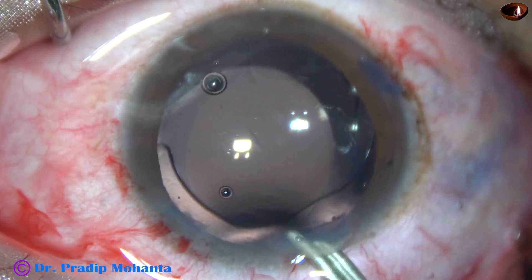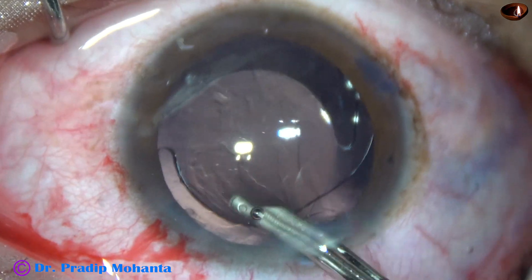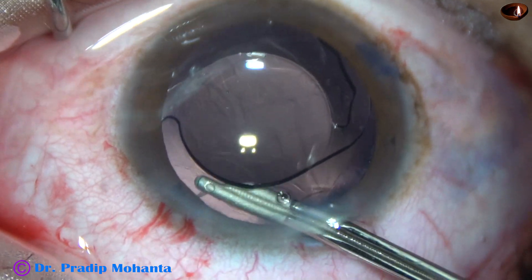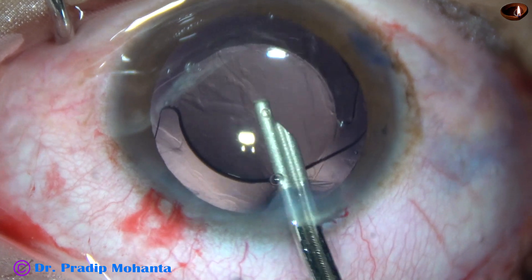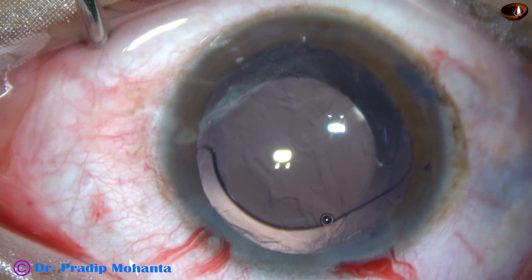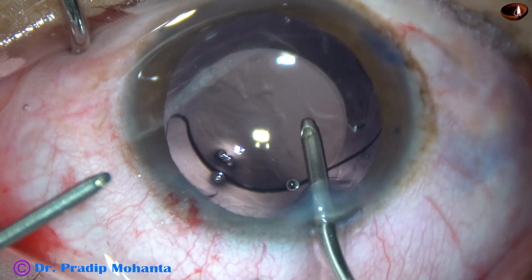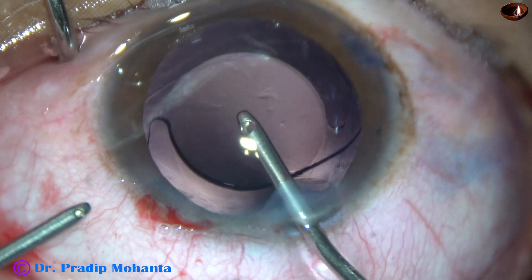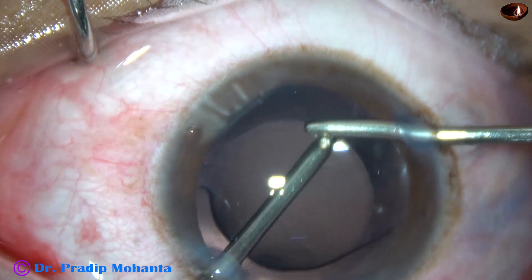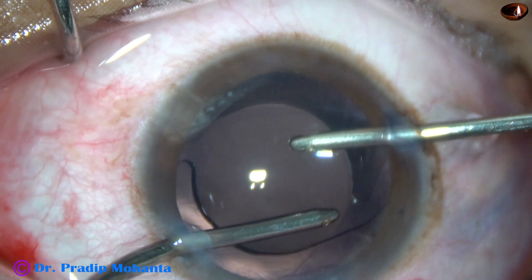And now we must dedicate some quality time to remove the viscoelastic. This is irrigation by the Simcoe — actually, this is double irrigation. Irrigation is occurring and we are flushing out some BSS through the aspirating port. By this double irrigation, most of the viscoelastic comes out. And now I take the irrigation-aspiration cannula. The irrigation cannula is used first to irrigate the anterior chamber. Now irrigation and aspiration is being used together to remove the viscoelastic. Now I am in IA2 mode to remove some lens fibres sticking to the undersurface of the anterior capsular rim.